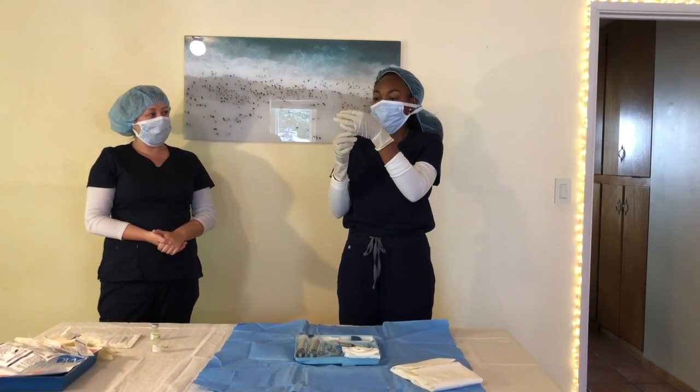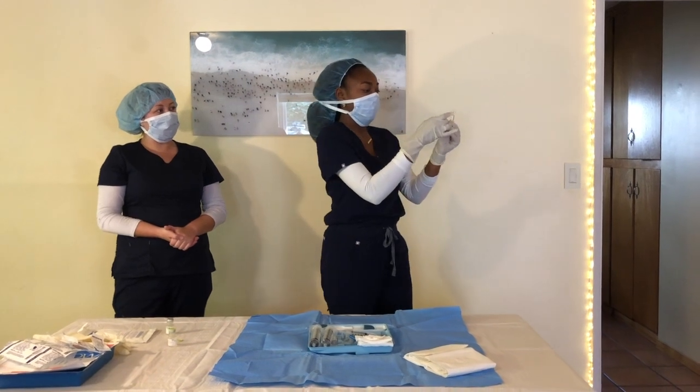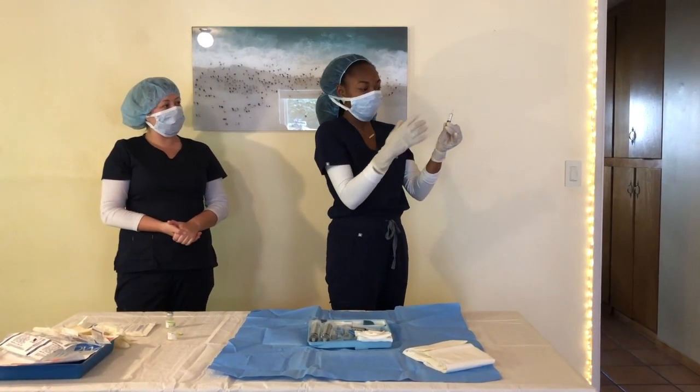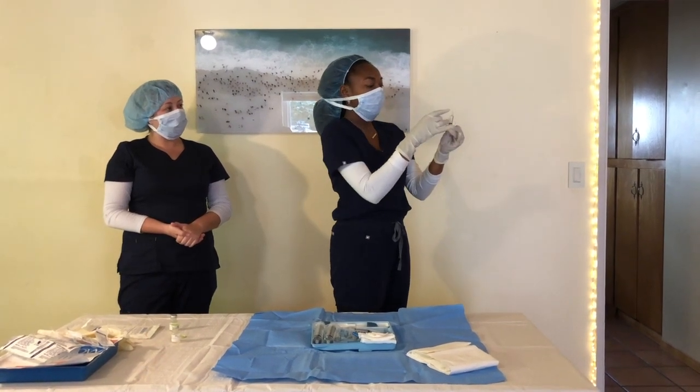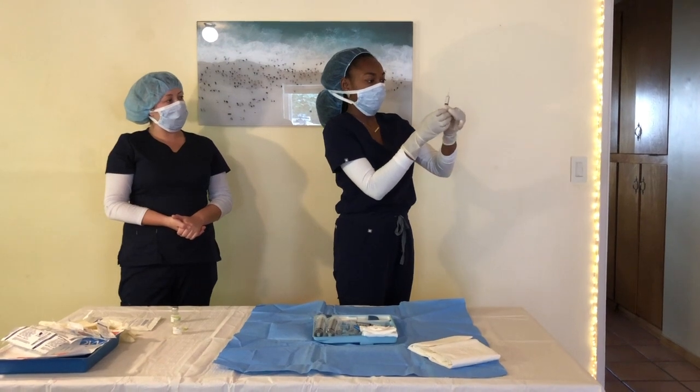Air. I'm gonna make sure that there's no air in it after I flick it hard. Also, I know I did that over the sterile field. That's a no-no. Don't flick your fluids over the sterile field. I'm gonna make sure the air bubbles are out, and they are. Sometimes you have to roll it.